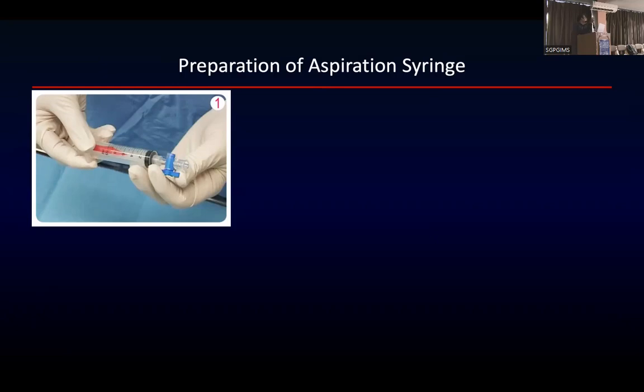Okay? Studies tell you with or without suction doesn't matter, though there are guidelines, ESGE guideline है जो बोलती है कि 10 ml suction, 10 ml syringe का suction routinely सब में use करना चाहिए. But just logical thinking is, when there is a hard lesion like pancreatic adenocarcinoma, जिसमें suppose in the setting of chronic pancreatitis, you have so much of desmoplastic reaction that अगर आप suction नहीं लगाते तो material नहीं आता. अगर suppose कोई soft structure है जैसे lymph node, अब lymph node में आप suction बहुत लगा देंगे तो blood आ जाएगा.